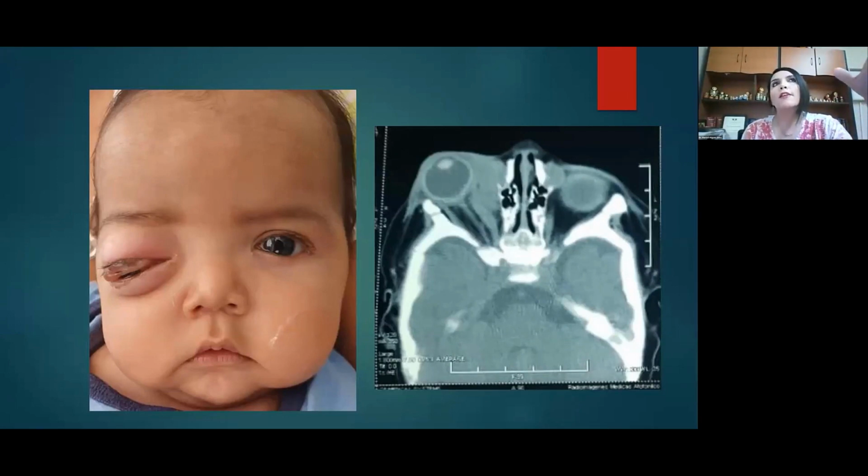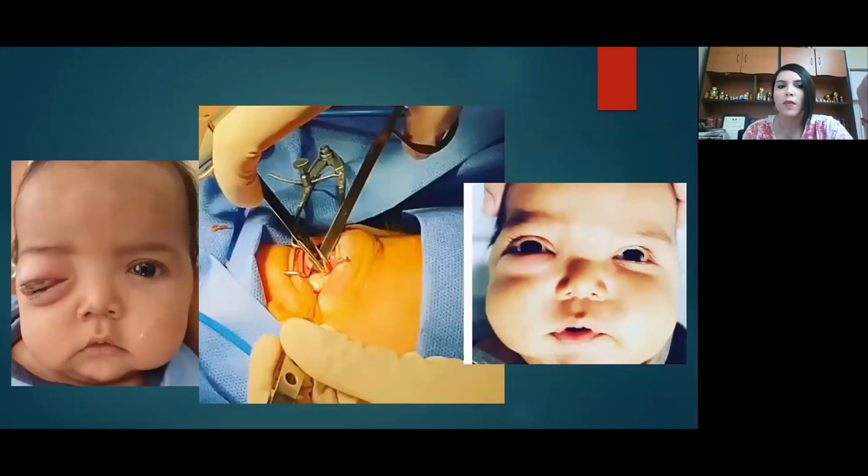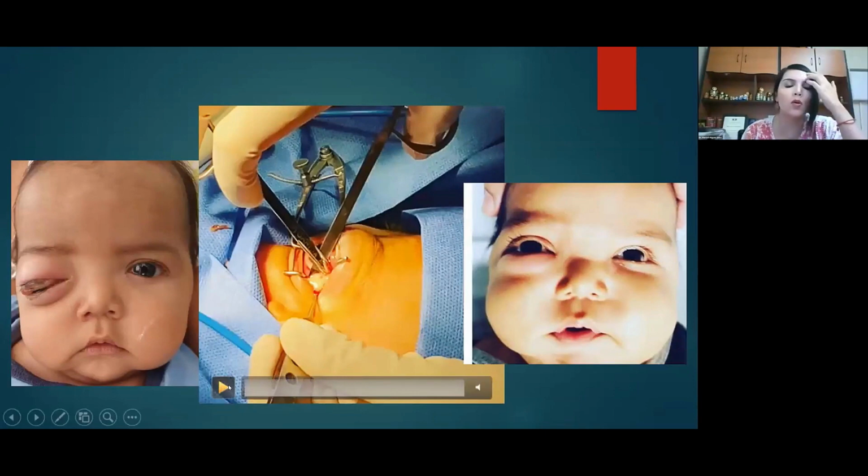So it's not a tumor, a real tumor, but it's a mass that is located in the medial wall. So we must arrive in a way that does not make a scar in a guy so young. So it's a very good moment to arrive transconjunctival. And here's the video. With the tomography, we know that the brain is safe.